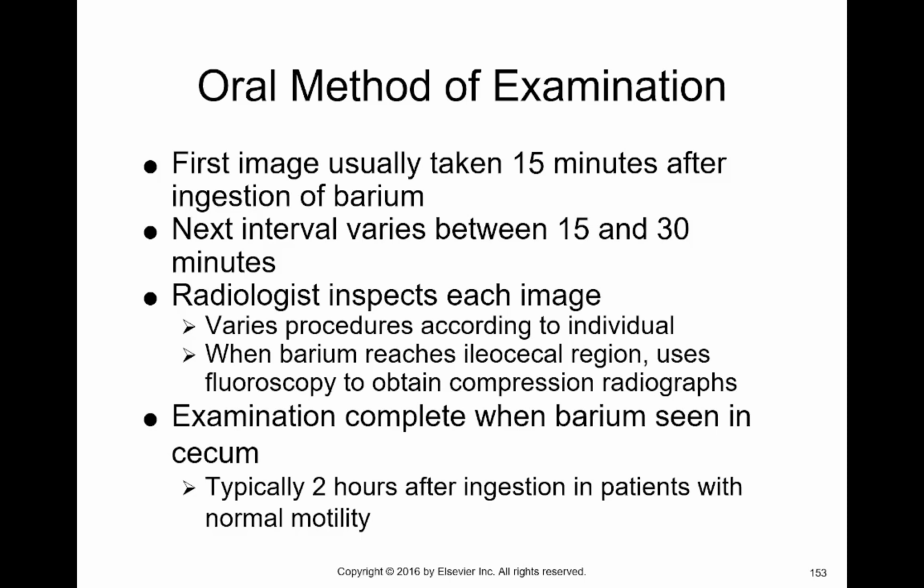So again, just your order of operation. The first image is taken 15 minutes after ingestion of the barium. The next is going to be about 15 minutes later. If it just looks like it didn't move at all on the first 15-minute image, then your radiologist may ask for 30 minutes.